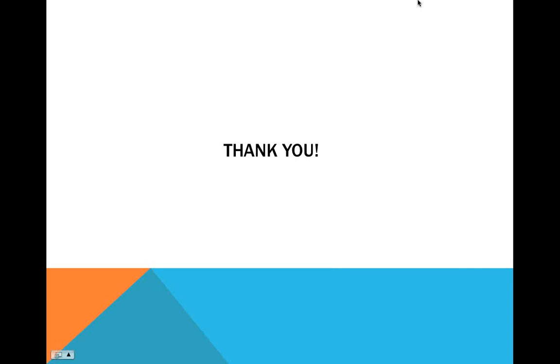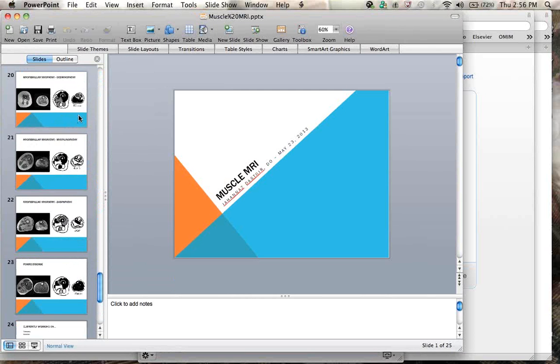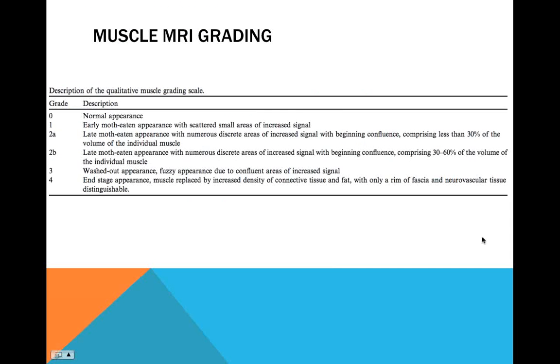So I'm really particular about how we read these MRIs, and I would like to consistently grade them according to the standard that I listed earlier. Because you'd be surprised, a lot of times these MRIs get done and they get read by musculoskeletal radiologists who focus mostly on muscle MRI for myositis. So they'll say there's no evidence of inflammation or there's fatty replacement and inflammation, but nobody's giving any of these a score. Nobody's really describing these in detail, and it's actually been a lot of the neurologists, or the neuromuscular specialists, that have been doing this.